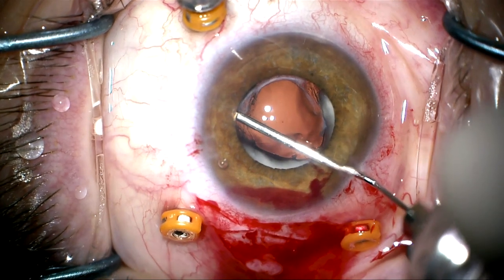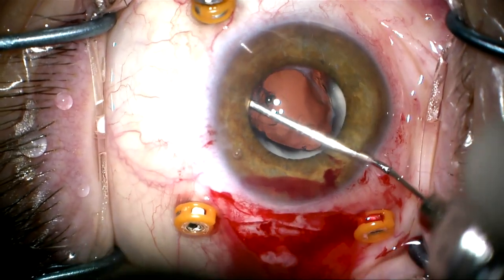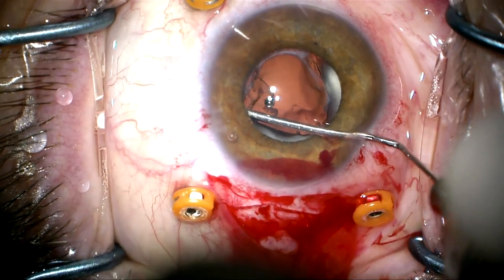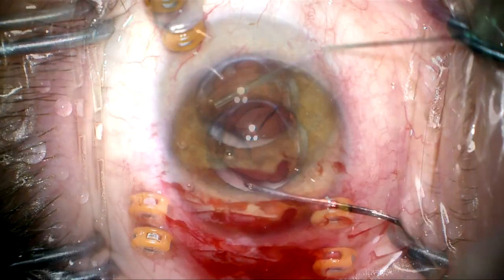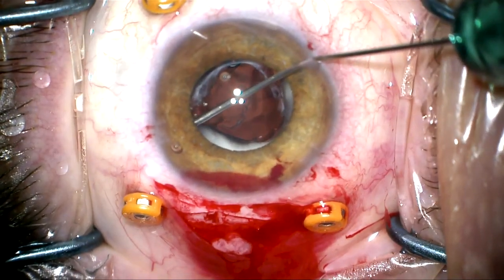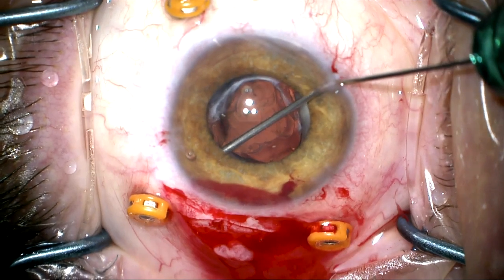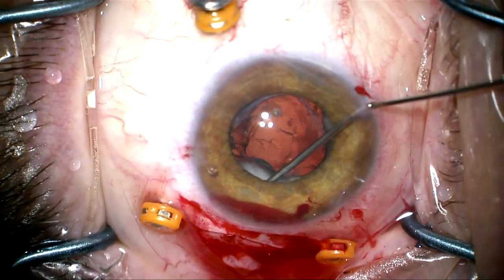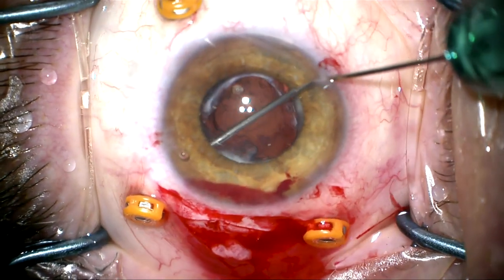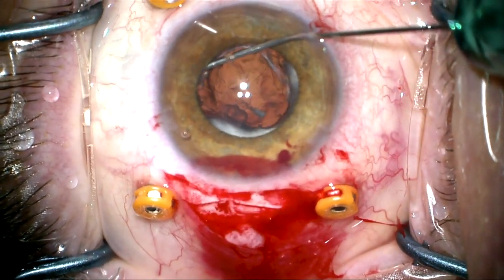The anterior and posterior capsule, which are fused together, are now going to be reopened using dispersive viscoelastic on a LASIK cannula. I'm going to try to creep in between the anterior and posterior capsule and create an opening. I'll now switch to cohesive viscoelastic and try to create a wave of dissection by introducing viscoelastic into the donut-shaped ring.